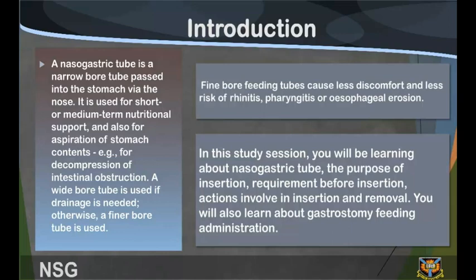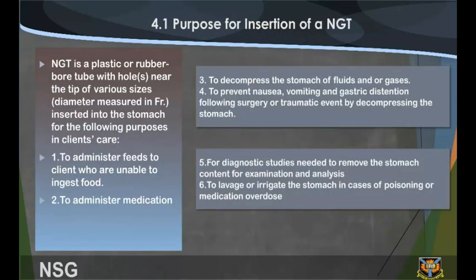In this study session, you will be learning about the nasogastric tube, the purpose of insertion, requirements before insertion, and actions involving insertion and removal. You will also learn about gastrostomy feeding administration. Purpose of insertion of the NGT.